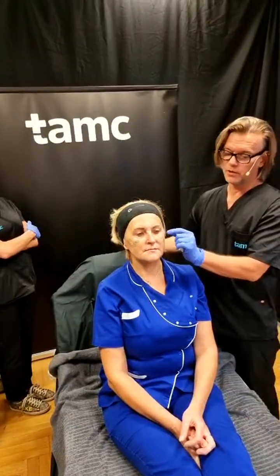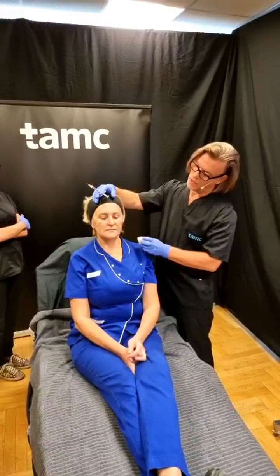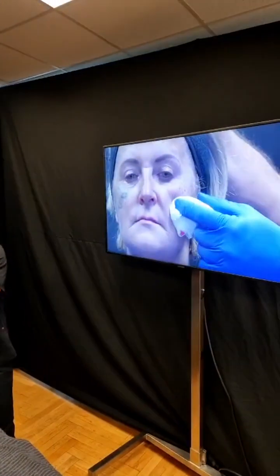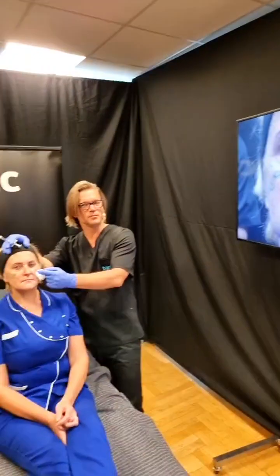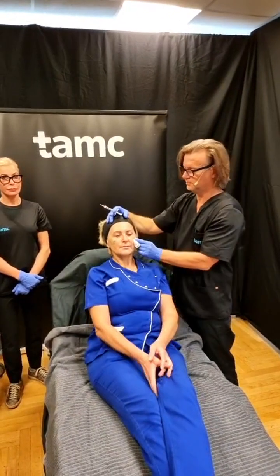And can you sit up straight? So you see a reduction of this shape, a reduction of that shape. And we'll be doing the other half in the other room where we switch to Palma for his model. Thank you so much. Okay, thank you, Tom.